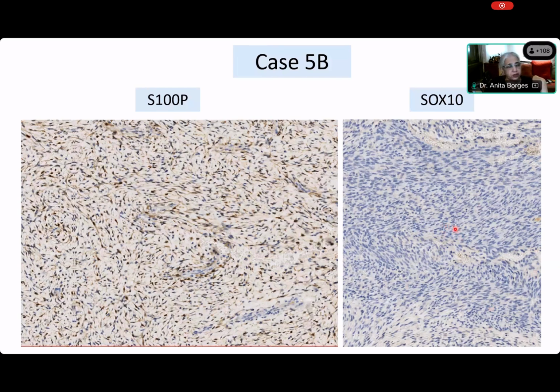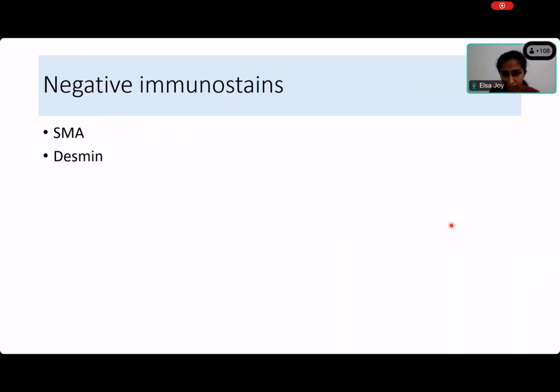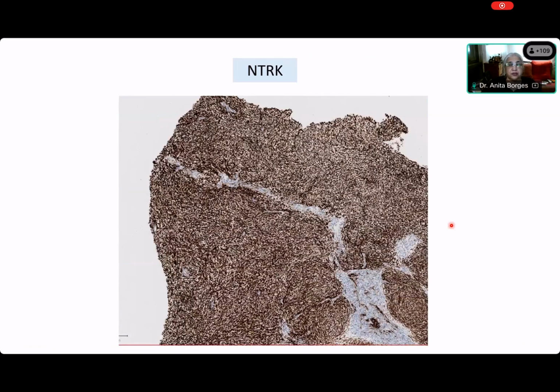SOX10. Positive or negative? Negative, ma'am. Negative, yes. And we have the other negative immunostains. There was no SMA, there was no desmin, there was no CK, there was no EMA, all right? But now we are beginning to realize that there are these funny tumors. They are spindle, they are often very low grade, they look like synovial sarcomas, they are fascicles, they show you co-expression of CD34 and S100.